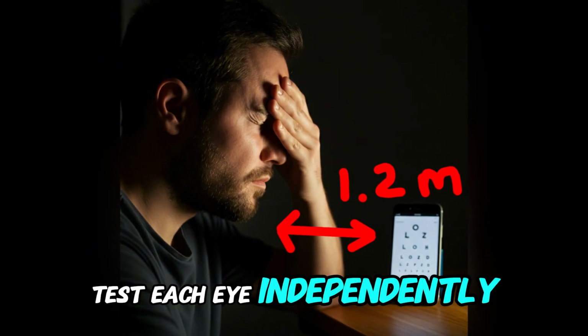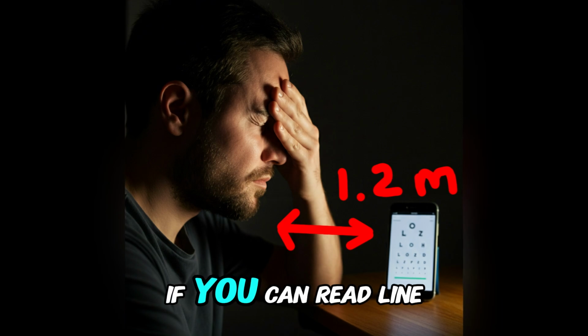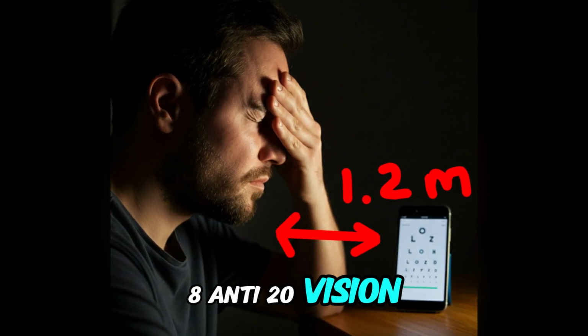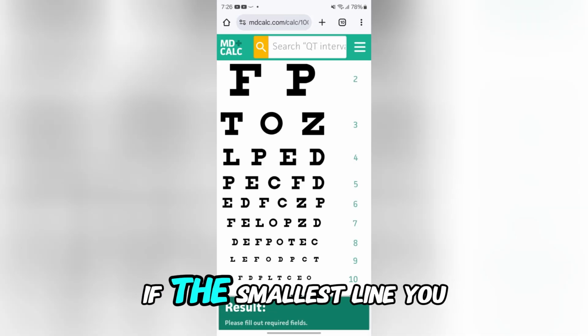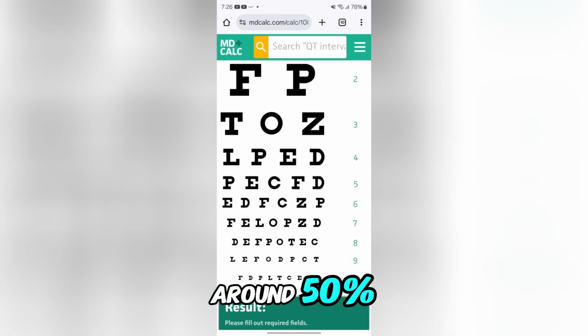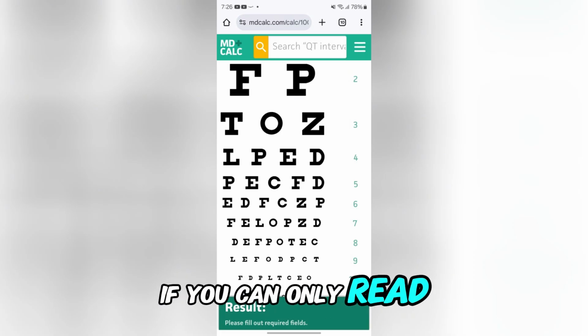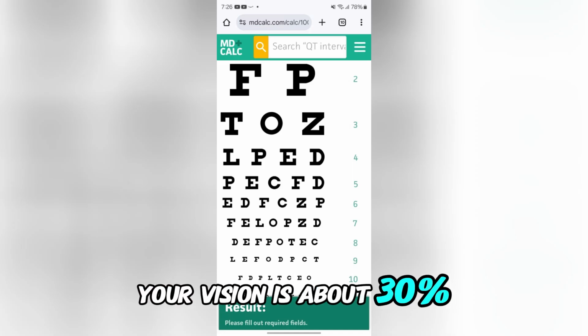Test each eye independently. The patient should completely cover the opposite eye. If you can read line 8 and 20/20 vision, your vision is normal 100%. If the smallest line you read is line 5, 20/40 vision, your vision is around 50%. If you can only read line 3, 20/70 vision, your vision is about 30%.